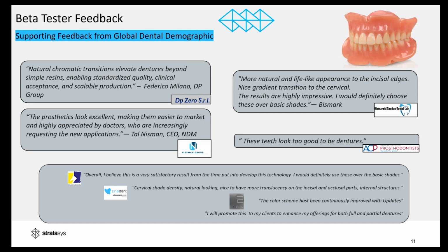I want to say that what we're introducing with TrueVoxel today shows the commitment we have to aesthetics and to continuing to be the producers of the best looking dentures in the market. This is the initial step. This is introducing new capabilities that, as usual, are going to continue developing and becoming more complex and better looking throughout the future. And I'm very excited to have all of you try it out very soon.